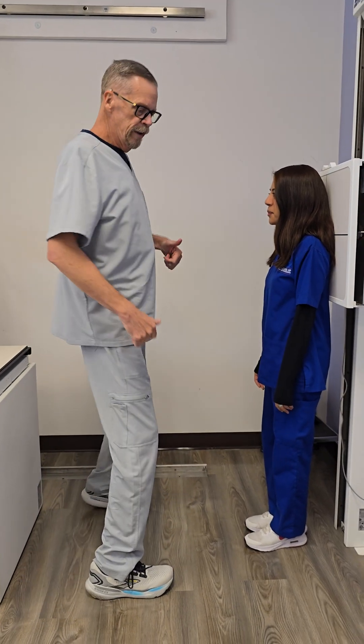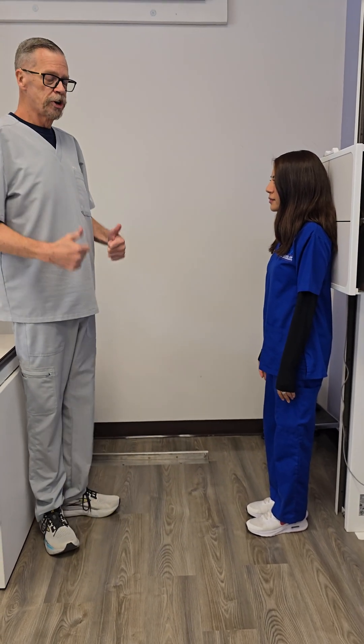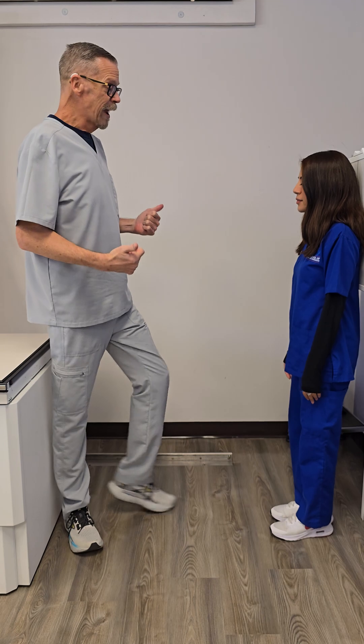Today we are going to be doing C-spine projections. We're going to start with our lateral.